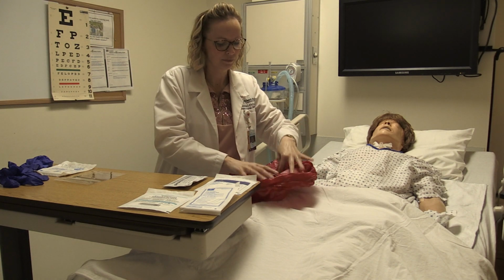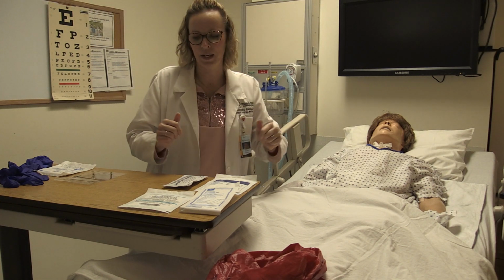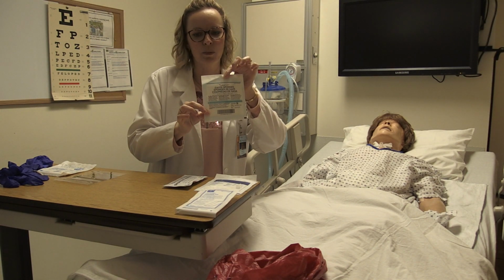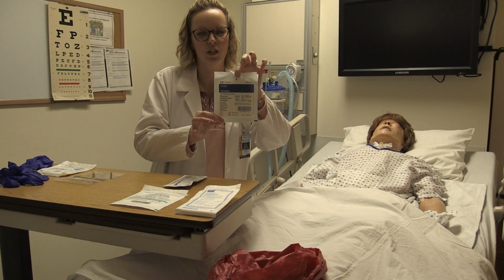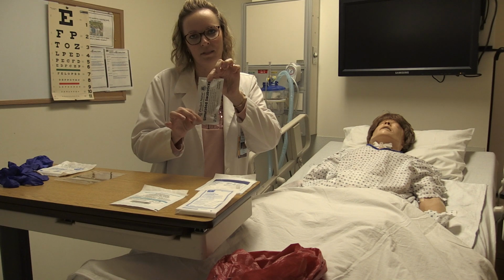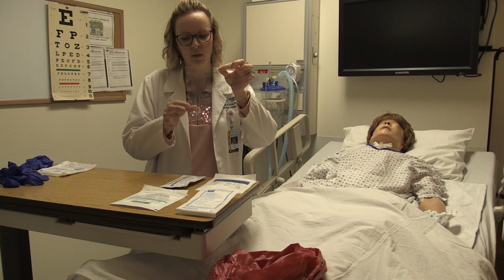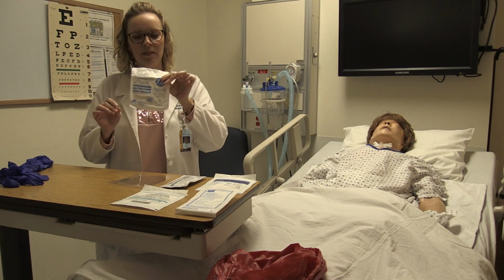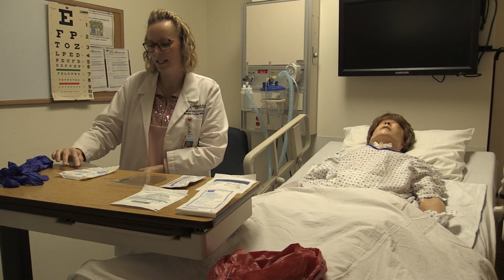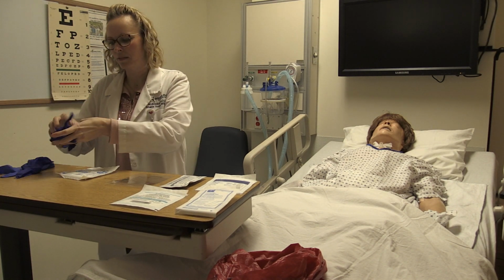biohazard bag here. I'm going to put that down here so you guys can see what I'm doing. I also have an abdominal pad, gauze sponge pads, drain sponge, and also swab sticks that will simulate a cleaning agent. I also have a measuring tool, sterile gloves. I have already pre-pulled some tape, and I put my name, date, and initials on there. And I also had 2 pair of clean gloves.